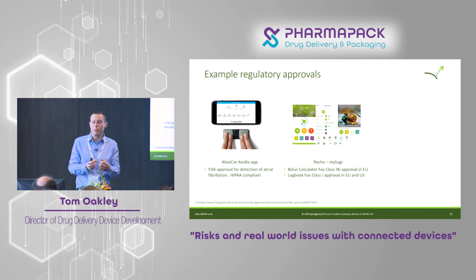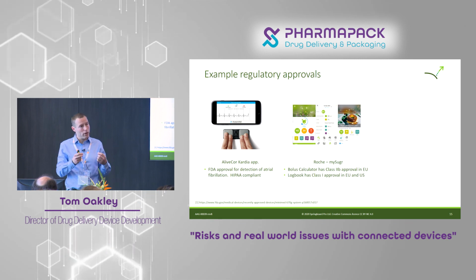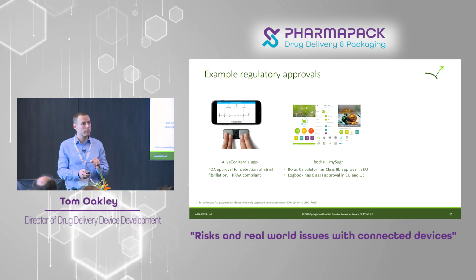And next up would be MySugar, which is almost like the Facebook for diabetes, if you like. And it's now bought by Roche. It has a bolus calculator, a logbook, and those pieces of software are regulated. They are approved as medical devices in themselves.